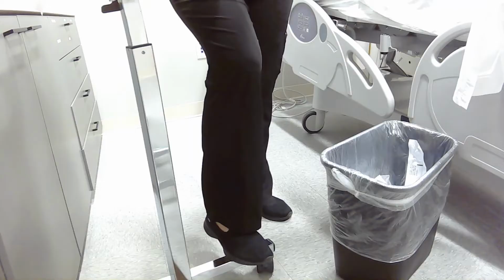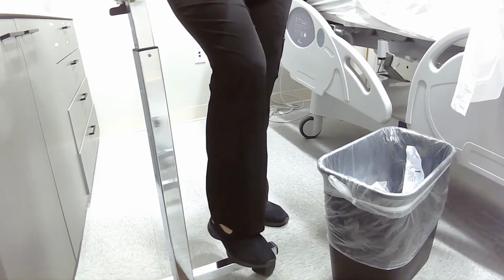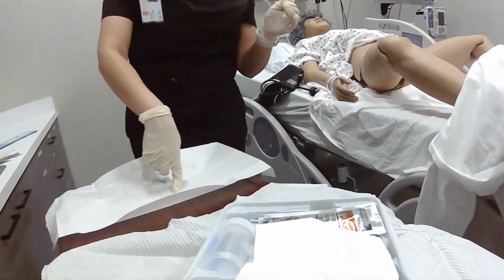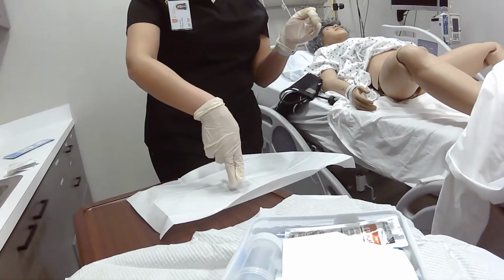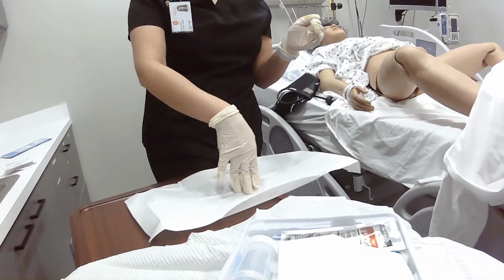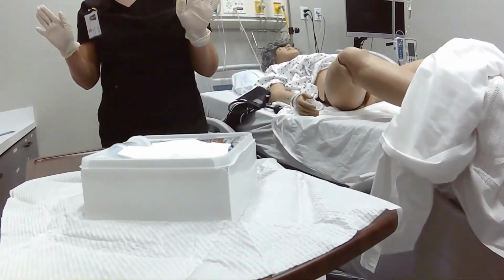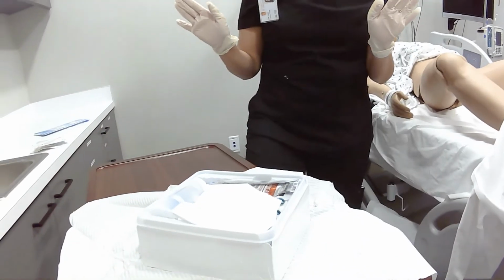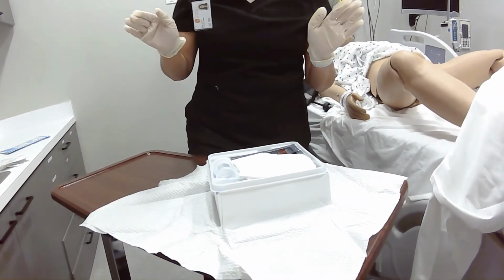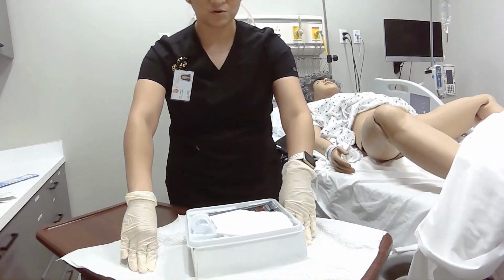So for this next part, I am going to get the rest of the supplies ready. Okay, I am going to just gently move that out of the way just by touching the inside. The inside of this wrapper is still considered sterile. Remember, I can't touch the non-sterile 1-inch margins. Okay. So for this next piece, I can now touch the inside of my kits.